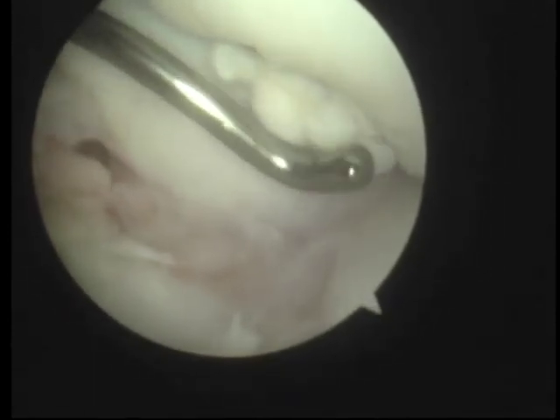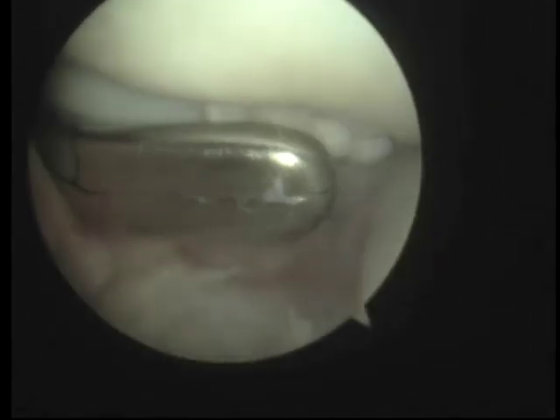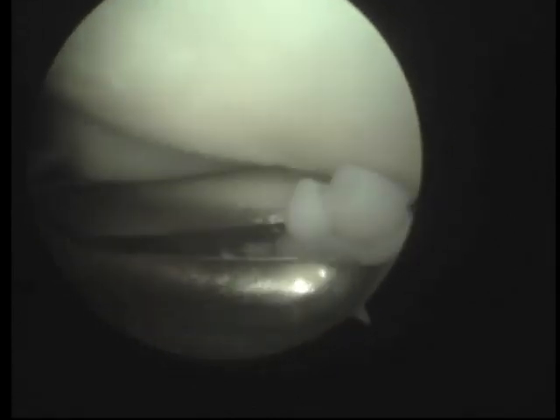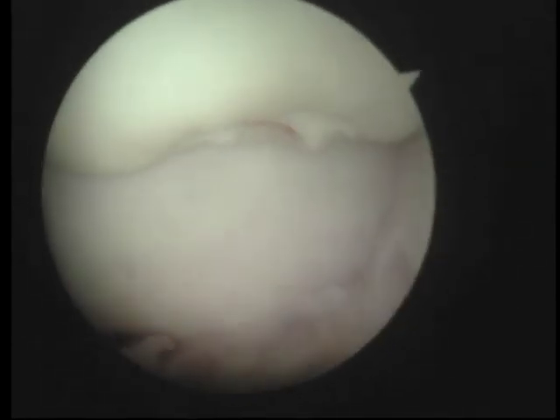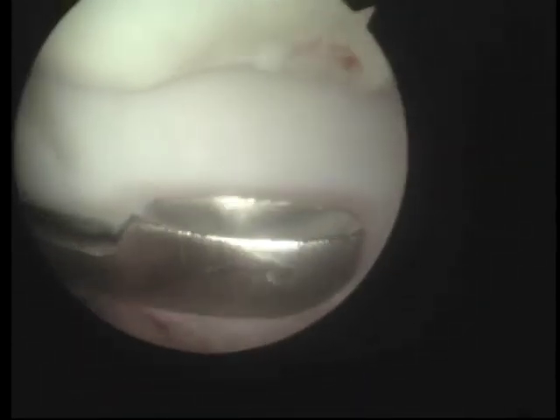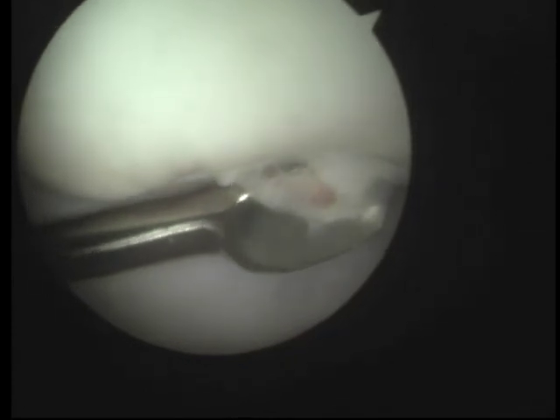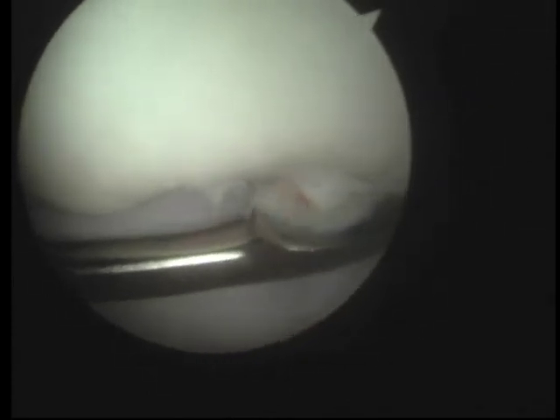So you can see that one there - that one's absolutely wiggling in the breeze. We're going to our grabbers, which are probably about the size of your little finger. We take out that fragment and then it'll be sitting in a fracture bed which will be a little bit crumbly, so we go in with our curette and we take that out as well. Horse bones are like concrete, so this curette you just can't over-curette them because it isn't sharp enough.